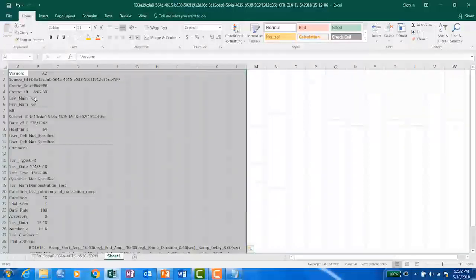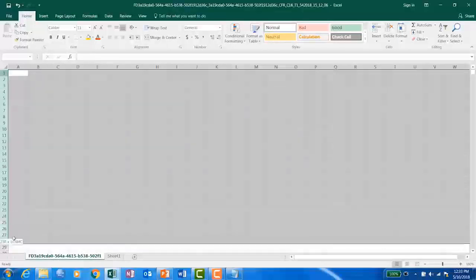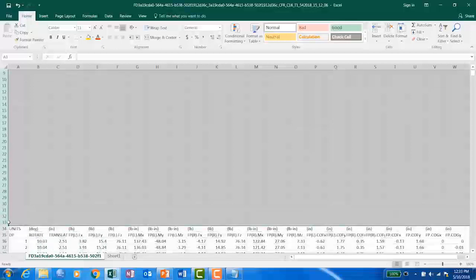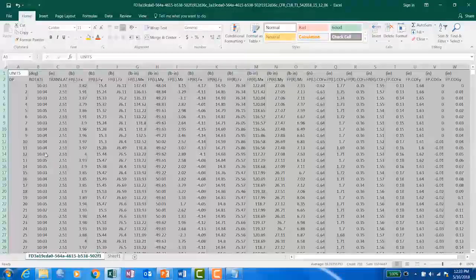And I can label that patient information or trial information. But what it allows, once I clean up this, then I can actually get rid of these rows, and now I have a nice database from which to work. And you can see all the information along here.